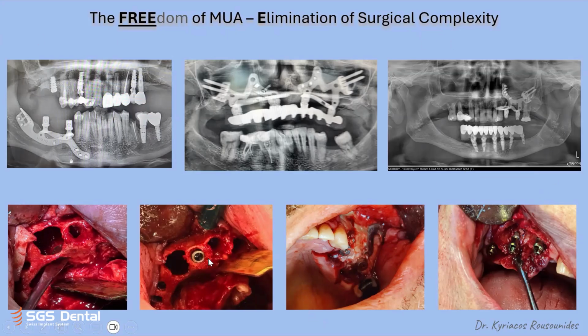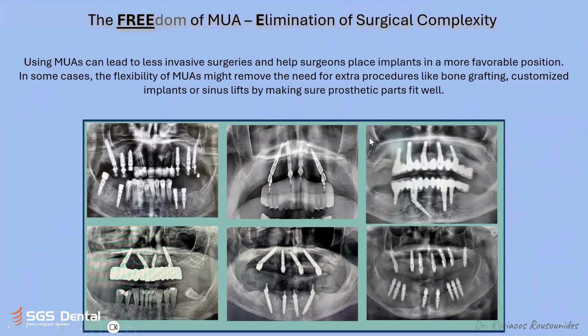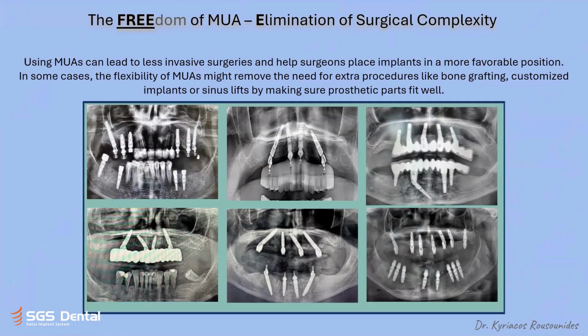Nowadays, everything is more corrected. You can see here, in this mouth, we placed first the subperiosteal implant, and after we needed to extract the canine here. And you see, we started using multi-unit in this area. This was directly at the time that we changed to the multi-unit abutments. And here in the green background, we see how we place our implants nowadays.